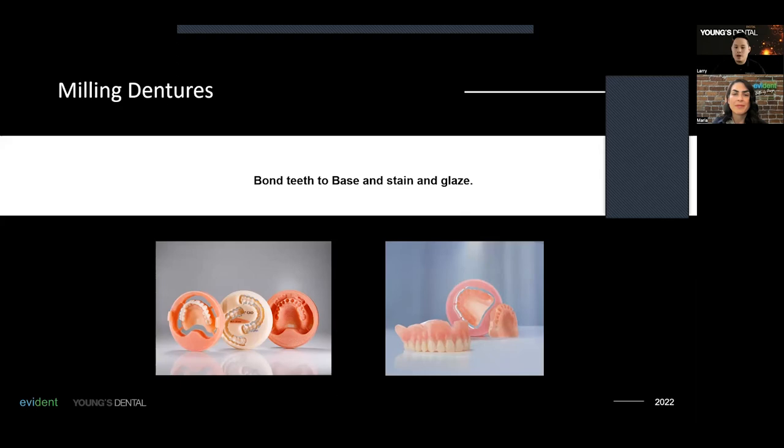Okay. So quickly, because I know that for those that are not super familiar with the processes themselves. So in 3D printing, there's a bit of a process once you've printed to kind of like wash, cure, do all that kind of stuff, right, and so on and so forth. With milling, what is that process? Just so that people have some bit of clarity.